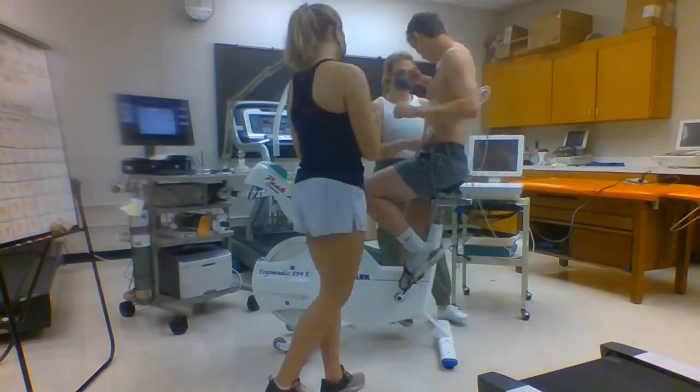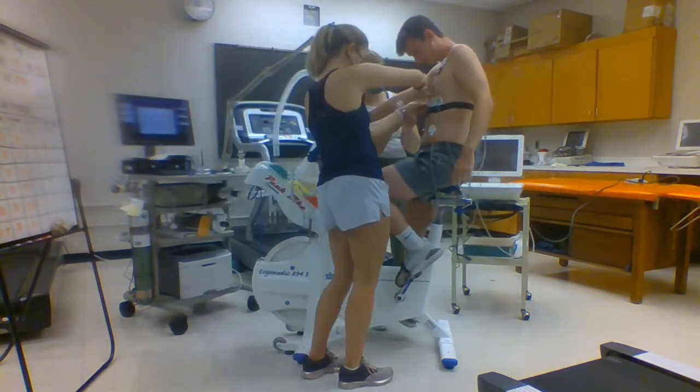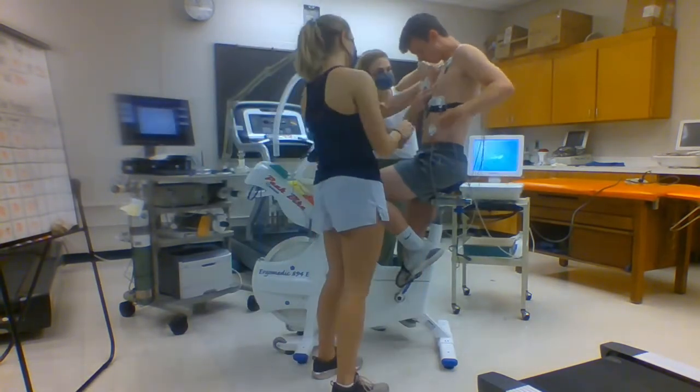First, we want to prep the individual for the ECG and get a resting ECG recording. Remember, a more in-depth overview of the GXT specifically and the measurements obtained during it and how the metabolic cart works specifically was given to you in your 420 class. Please refer back to that video if needed.